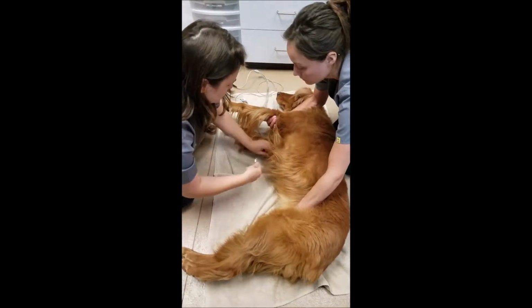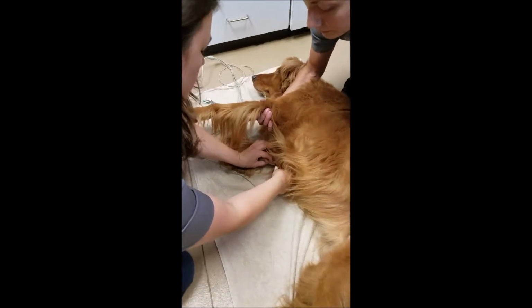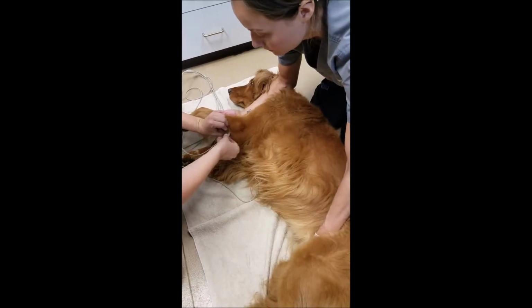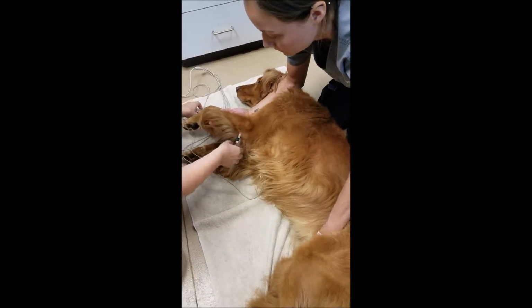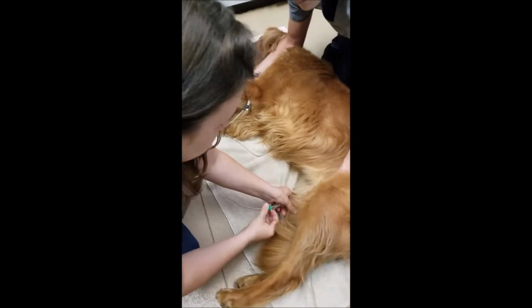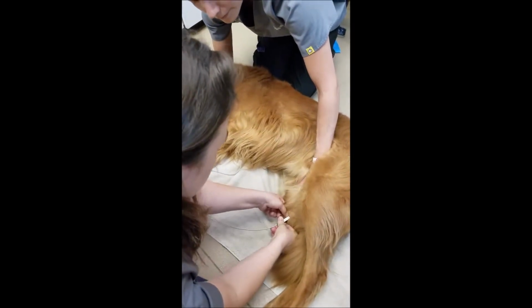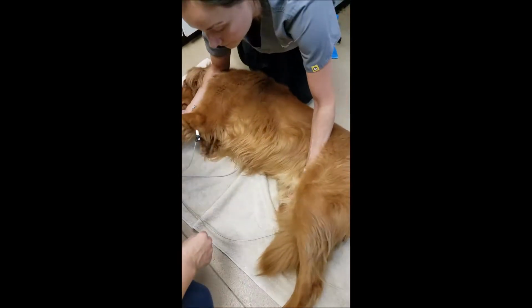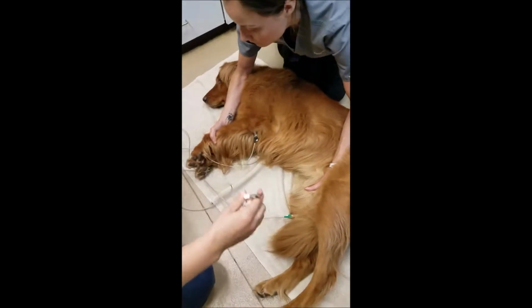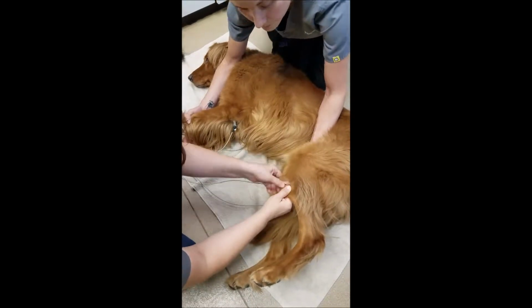And we're going to attach him distal to the elbow on the front. So the right arm is white. The left arm is black. The right hind, which is going to be distal to the knee here, is green, or about to where the knee is. And then the left hind is the red here.